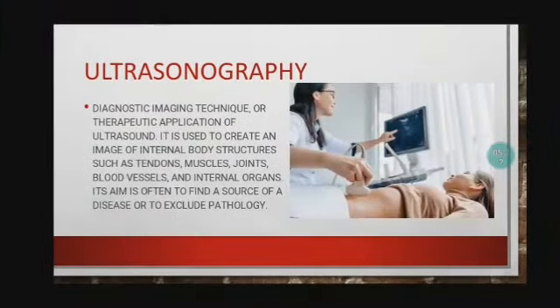Ultrasonography is a diagnostic imaging technique or therapeutic application of ultrasound. It is used to create an image of internal body structures such as tendons, muscles, joints, blood vessels, and internal organs.